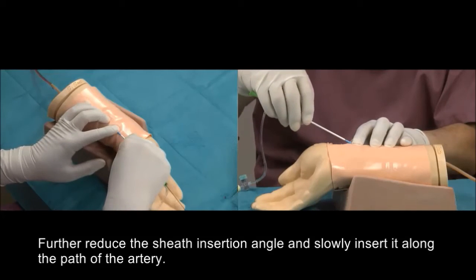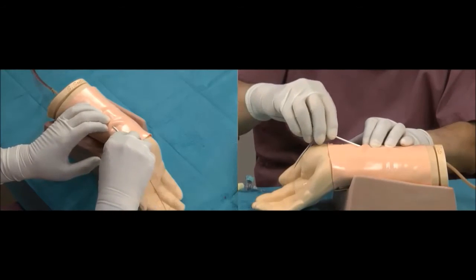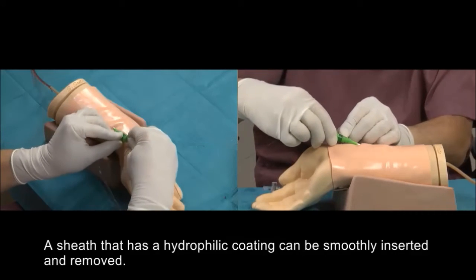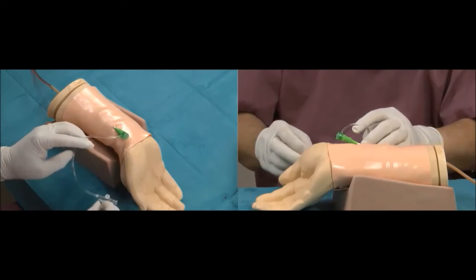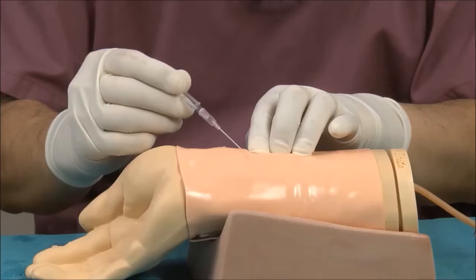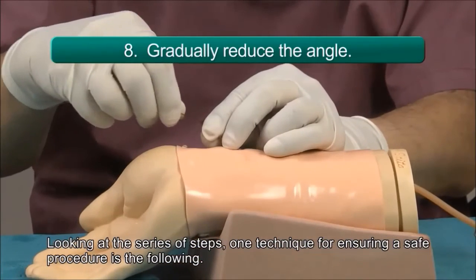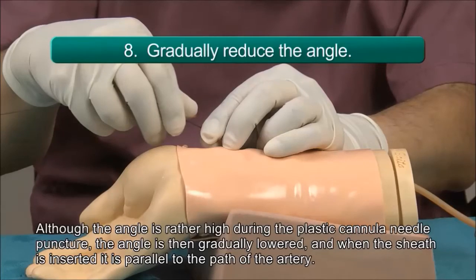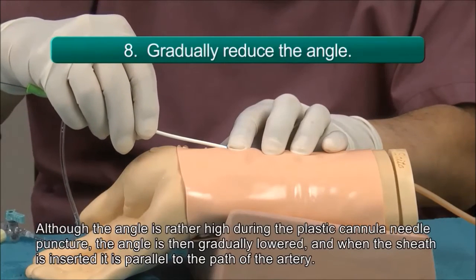Further reduce the sheath insertion angle and slowly insert it along the path of the artery. A sheath that has a hydrophilic coating can be smoothly inserted and removed. Looking at the series of steps, one technique for ensuring a safe procedure is the following: although the angle is rather high during the plastic cannula needle puncture, the angle is then gradually lowered, and when the sheath is inserted, it is parallel to the path of the artery.